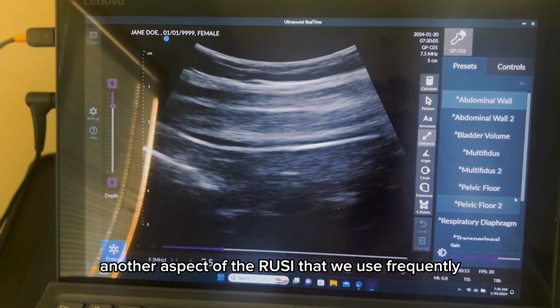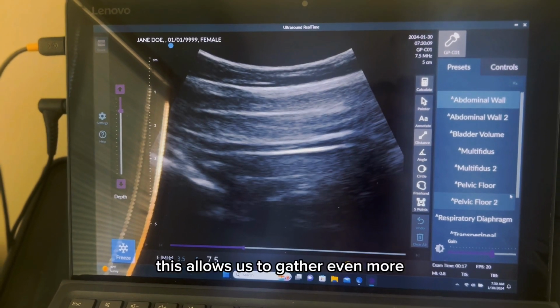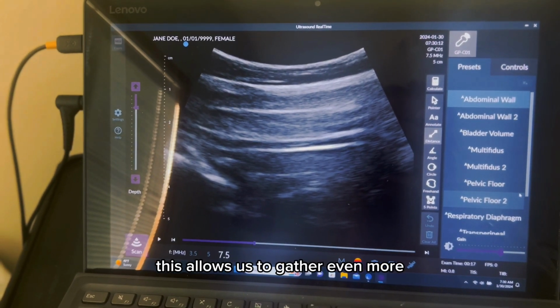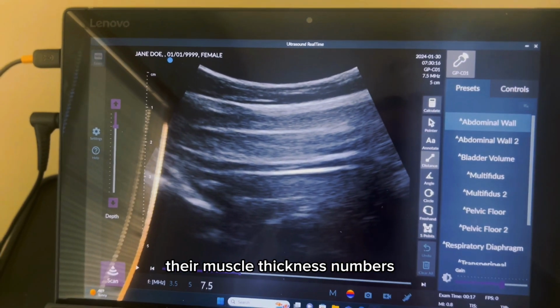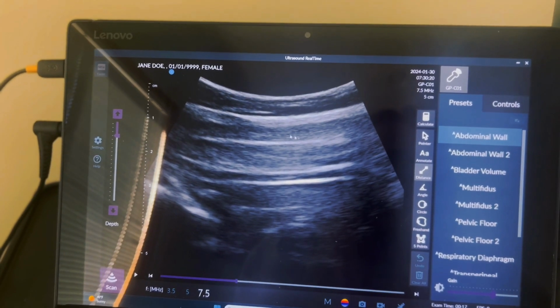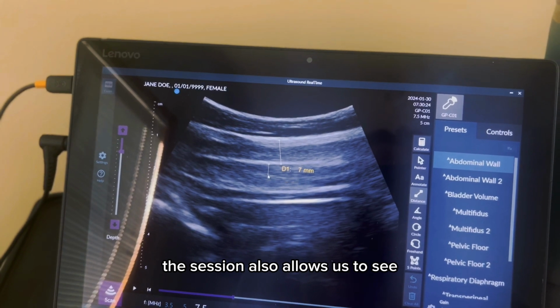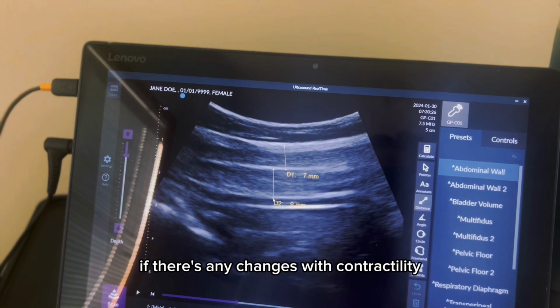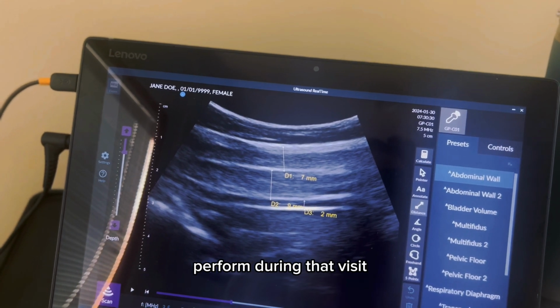Another aspect of the RUSI that we use frequently is the freezing and still picture feature. This allows us to gather even more objective data about a patient's baseline, their muscle thickness numbers, their diastasis recti distance, so that we have comparative measures. Gathering this data and comparing it throughout the session also allows us to see if there's any changes with contractility or relaxation practices that we perform during that visit.